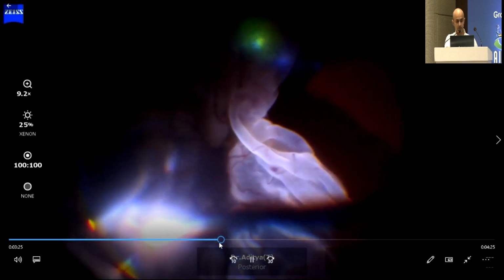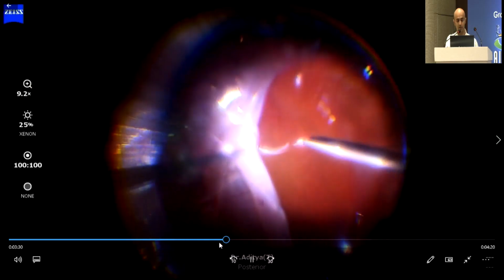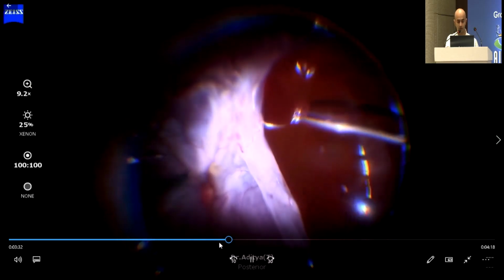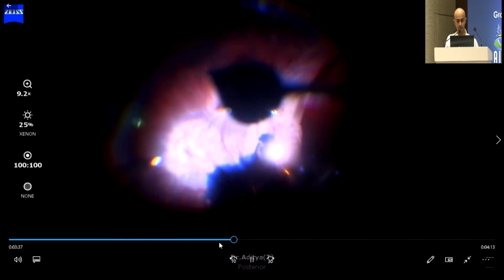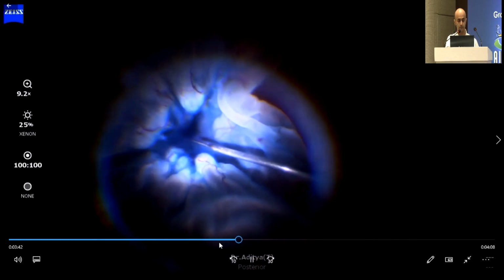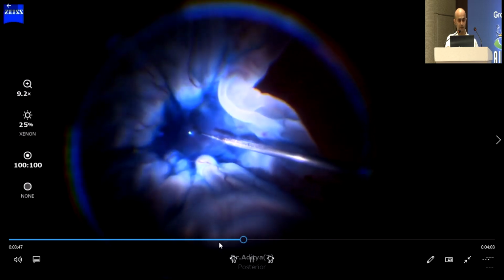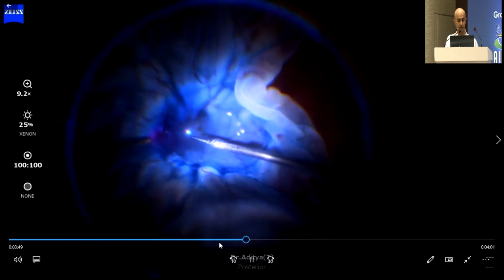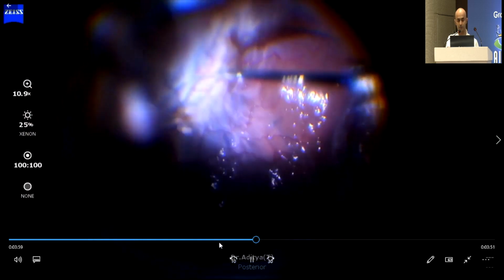So there is this GRT with PVR. We have tried to peel off most of the membranes, and then after that PFCL enters. A fluid-air exchange has been done to stain the membranes first. I wanted to peel these membranes under the PFCL because that will stabilize the retina a bit better, because it will otherwise be very difficult to peel off. So under PFCL we are able to get a grip on the membrane and peel them off. Most of the membranes are coming out quite okay.